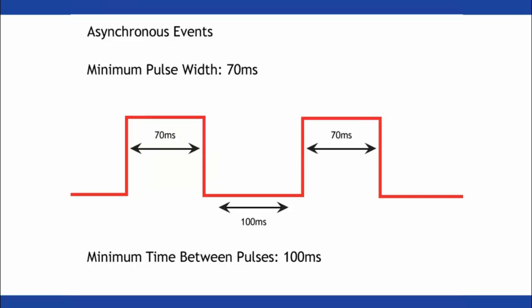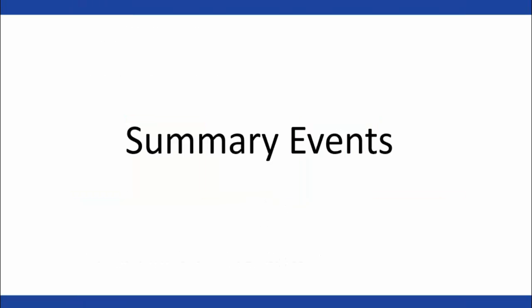So those are the two main differences in digital ports that you'll find on the different systems that we provide. Now we're going to talk about the different event modes. And we're going to do so by looking at the specifics of the digital port and what's going on each individual digital line and how that impacts the type of event that BioLab sees.